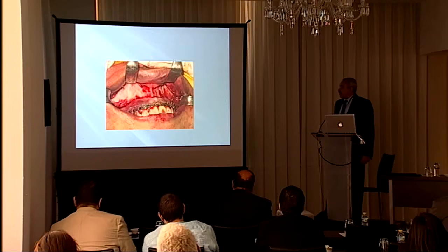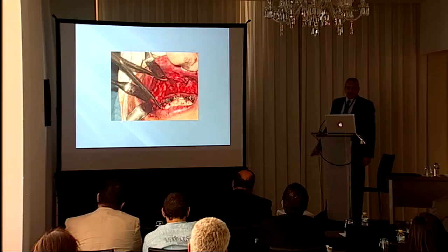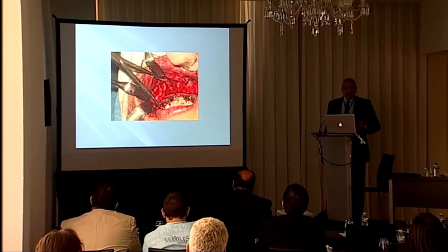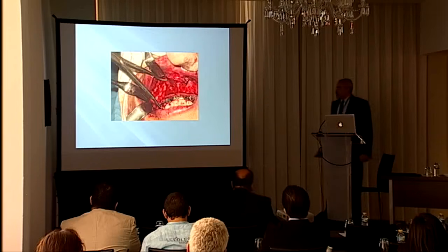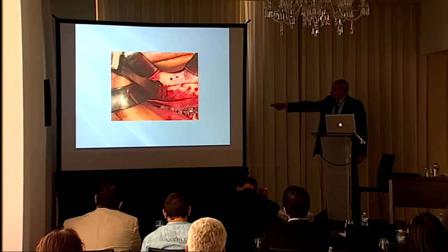And now here we open, the tissue is open. I started by doing the classical measurements that we do without the computer-guided splint. I still do it. I was a little afraid that one of my splints may not fit, so I can continue in the conventional manner. Now I stopped doing this step. And this is the pterygoid.